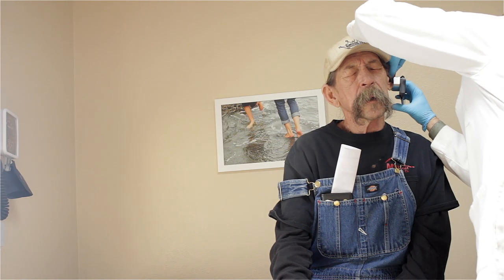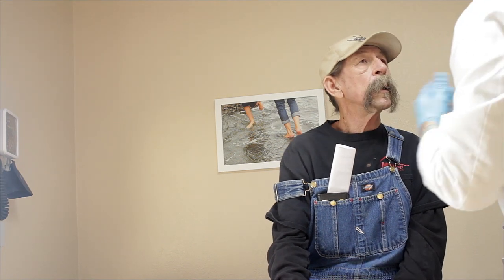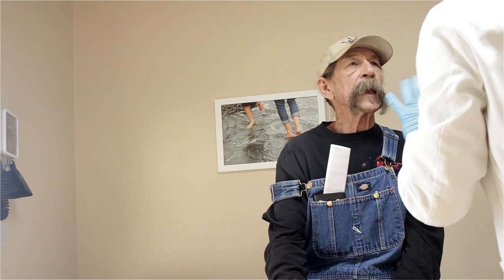So now we're going to dive in again. For those who wonder why I can't navigate this thing, it's because the image I'm looking at is reversed up and down and side to side. Am I hurting you at all? Not a bit. I'm going to leave whatever wax is remaining there because we don't like to totally get it clear — the ear needs to have a little bit left in it, and we cause injury if we try to get it perfectly squeaky clean.